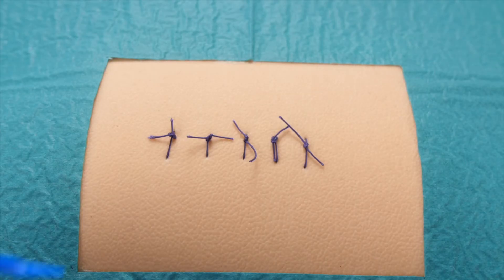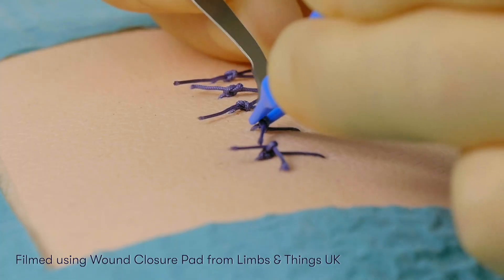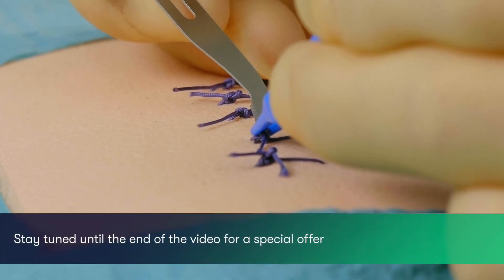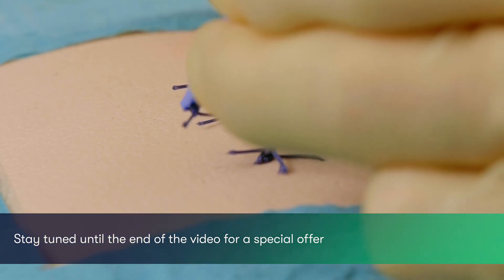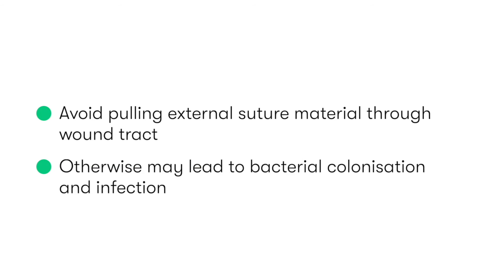We do this by gently grasping the suture knot with our disposable forceps. And using the suture cutter, we cut the suture closer to the surface of the skin. The forceps are then used to slowly pull the knot and suture away from this cut end. This ensures that the cut end of the suture is removed without unintentionally dragging suture that's been outside of the skin through the suture tract and potentially leading to an infection.